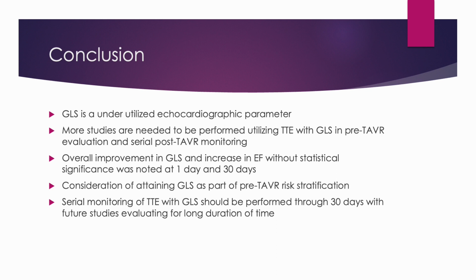Tracking the progression simultaneously with ejection fraction through 30 days and further should also be considered.